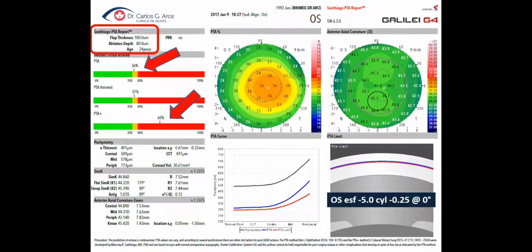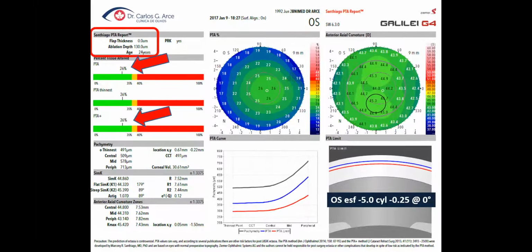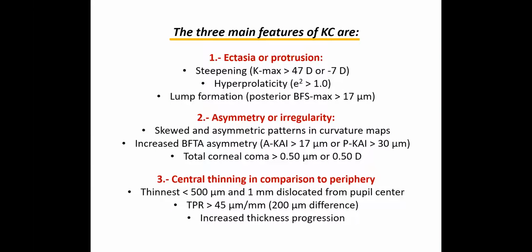Okay, I cannot do LASIK, but I can do PRK. PRK will have 26%. I am very conservative, and in very few patients do I do surgery with less than 500, but in this case, we did it, and the patient was well after applying, fortunately.